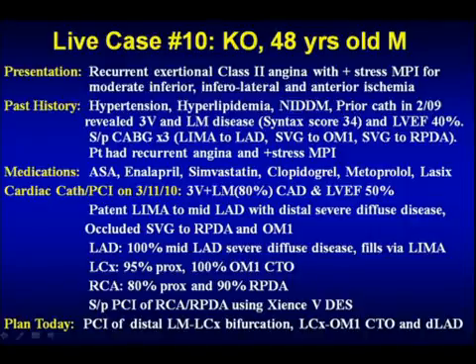That time because of extensive disease, and this is where will be the focus of our brief presentation today on the syntax score, the patient was sent for surgery, rightly so, appropriately indicated, had a CABG with a LIMA to LAD, SVG to OM1 and SVG to RPDA. As you can see there, only one arterial graft, 2 venous grafts, which is the routine practice. Many centers will put arterial bypasses, but in diabetics, there are some questions whether they will use an arterial bypass. But I would say you take 100 of these patients, 90% will get the LIMA and 2 vein grafts.